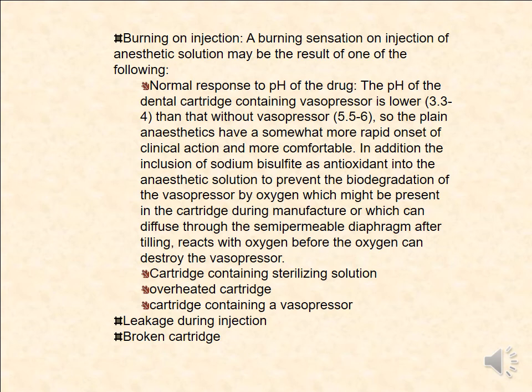The cartridge containing sterilization solution. The use of a sterilization solution that affects the stopper or diaphragm can lead to the entering of the solution into the cartridge and lead to increased burning on injection. Overheated cartridge: a frozen cartridge that is put directly on the flame leads to an overheated cartridge. For a cartridge containing a vasopressor, this leads to acidity, and this does not work within the pH of the body.